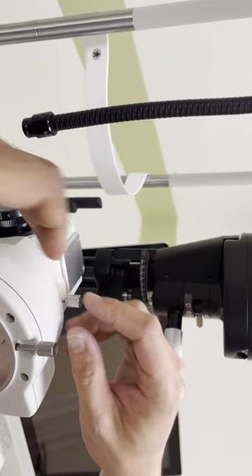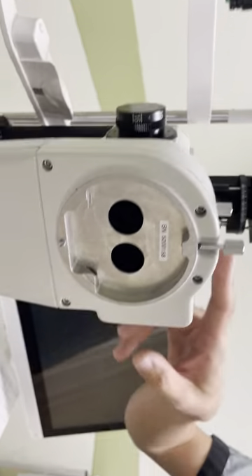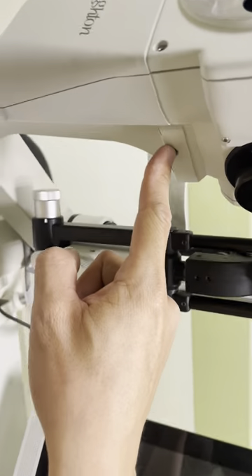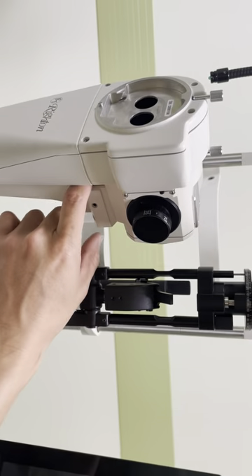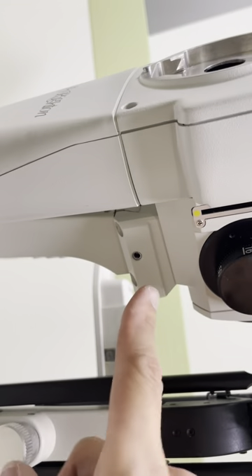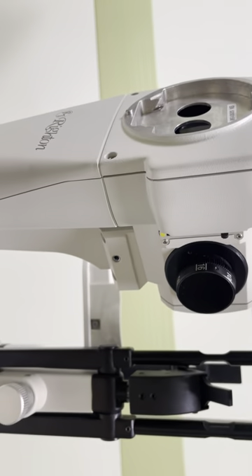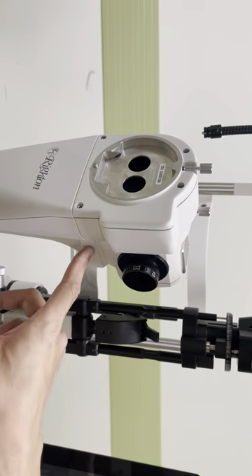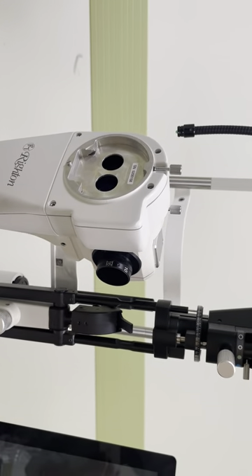This is a loosened part. To loosen the magnification drum — we call this the magnification drum — you need to loosen this. There is a slot here; just slide it to the back side, back to the patient side. Make sure to tighten back when you slot it in.